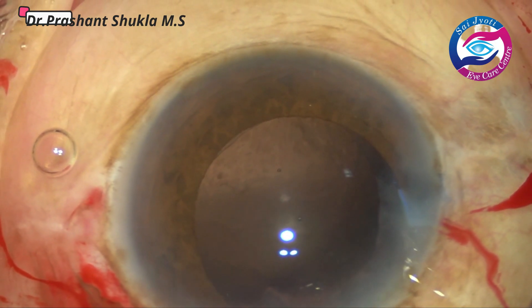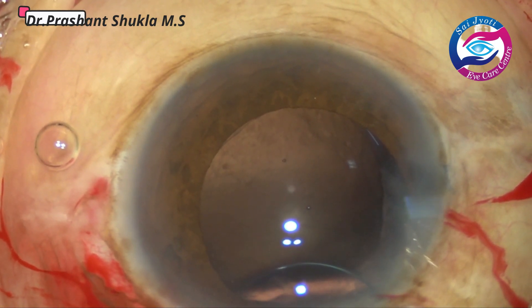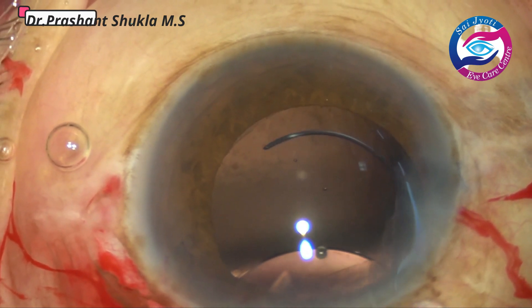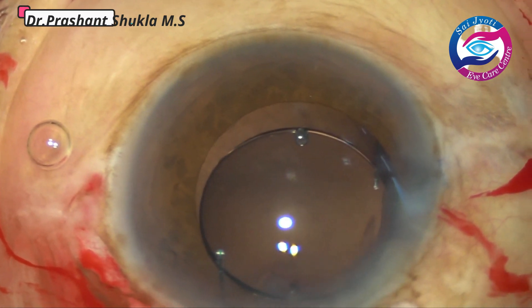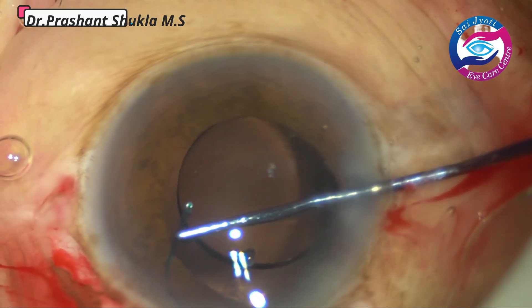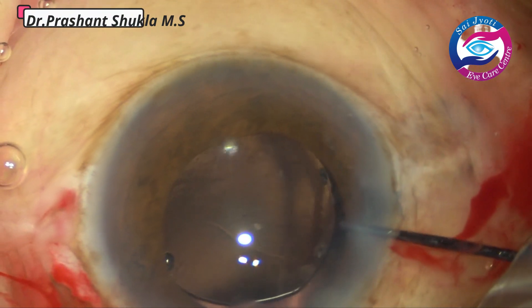In this case I am implanting a PMMA lens — this is how the 3-piece PMMA lens goes into the eye. The haptic is directed to go below the anterior capsular margin. Now is the time to dial the other haptic. The ball Simcoe is used, the optic-haptic junction is held, and the lens is dialed into the capsular bag.